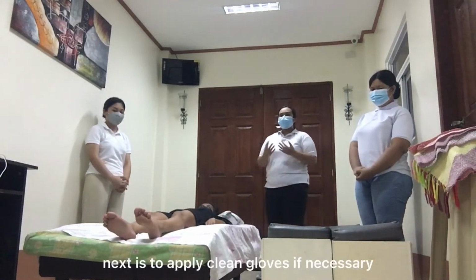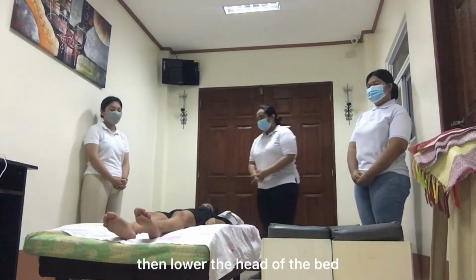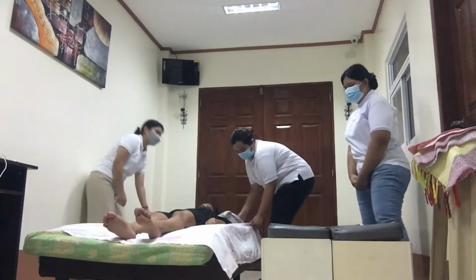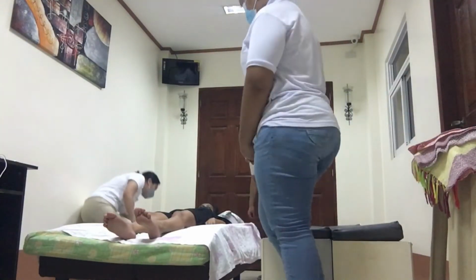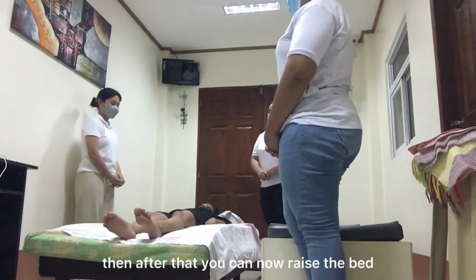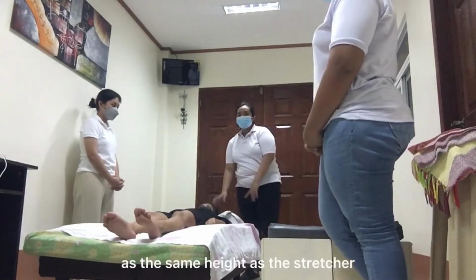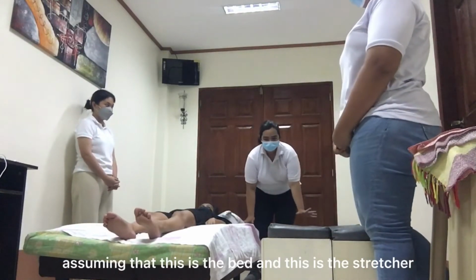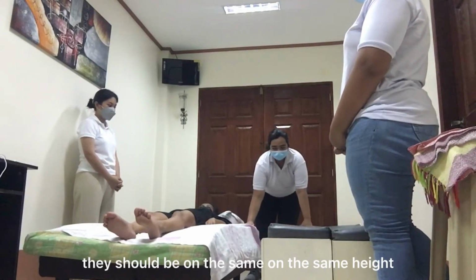Next is to apply clean gloves if necessary. Then lower the head of the bed until the patient can tolerate. Next is to ensure the locks of the bed. Then after that, you can now raise the bed to the same height as the stretcher. Assuming that this is the bed and this is the stretcher, they should be at the same height.